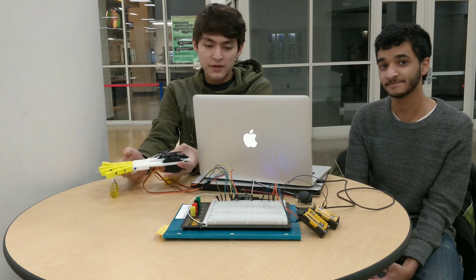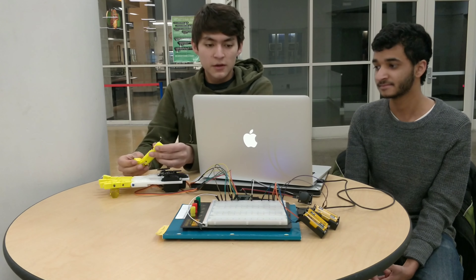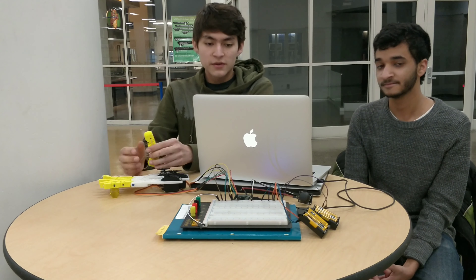My name is Parker and my name is Hasha. We're both seniors at Skyline High School. The name of our project is 3D Printed Prosthetic Hand.